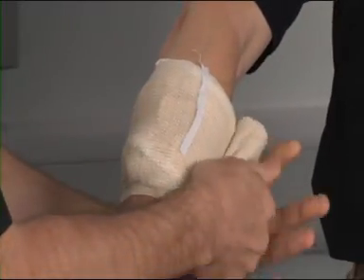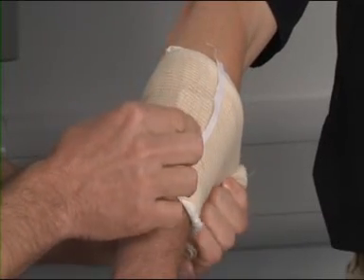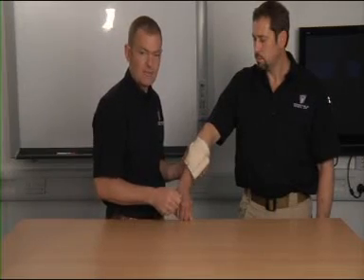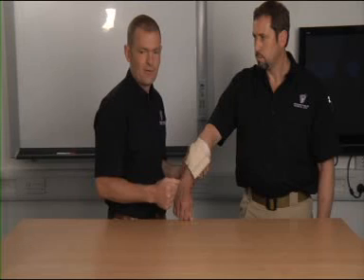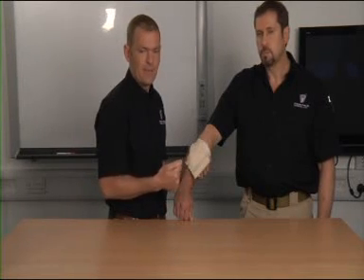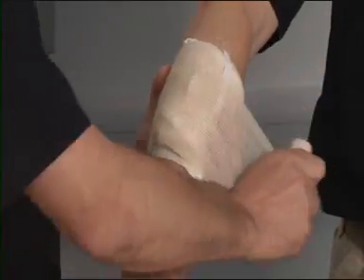As I apply the bandage, one of the useful features of this dressing will become apparent: throughout the dressing there are thin strips of hook and loop material that will effectively act as a brake should I inadvertently drop the bandage during application. In practice, if we drop a bandage and it rolls across the floor, it's very difficult to effectively reassemble it to apply it back onto the casualty, so having these little brakes makes life a bit easier as we're putting the bandage on.